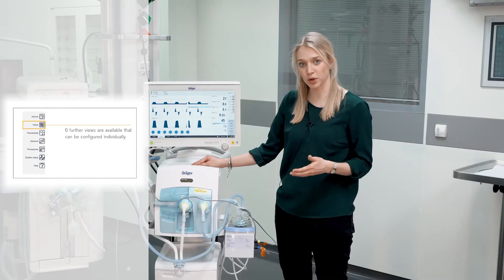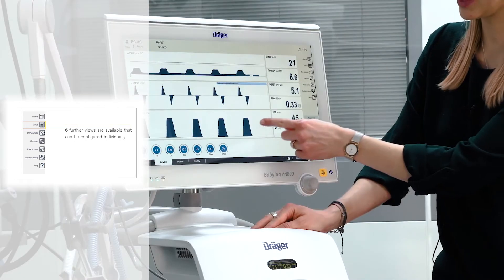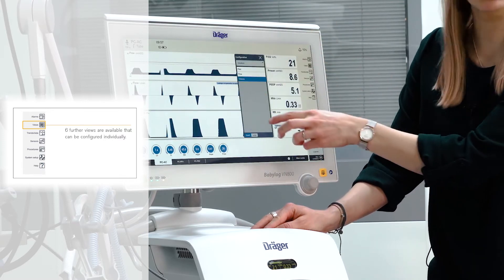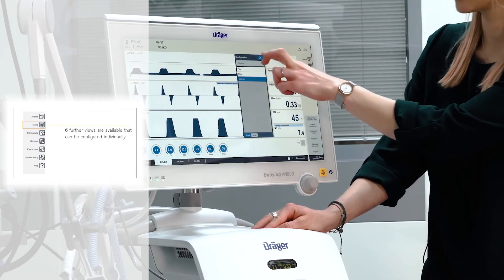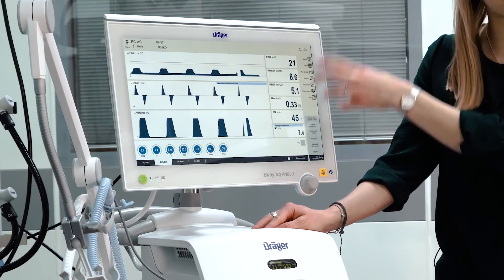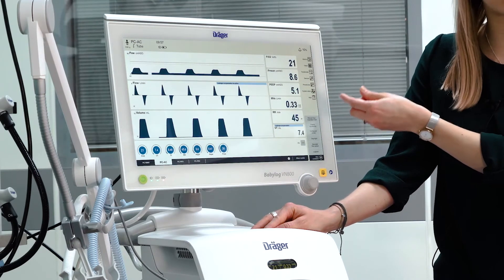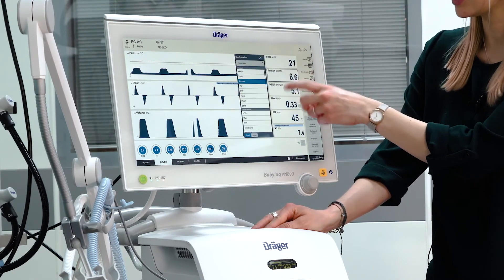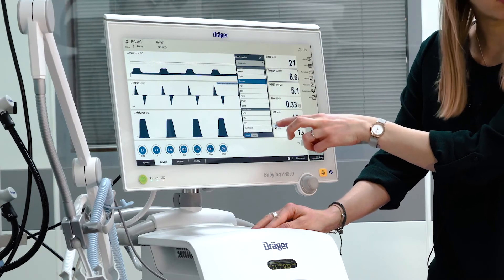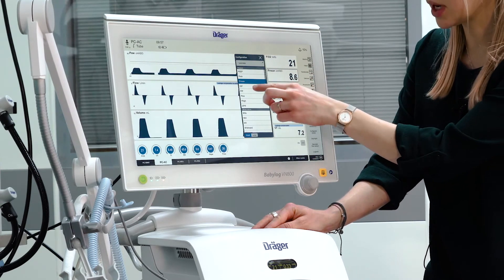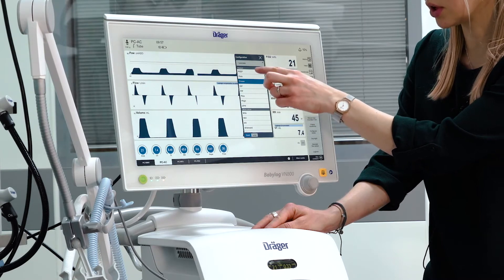To apply changes to the monitoring area, select the respective waveform and choose a different parameter from the list. If you want to apply changes to the measurements, in the same operating philosophy, select a parameter box, choose a different parameter from the list, and apply the changes by pressing the rotary knob.